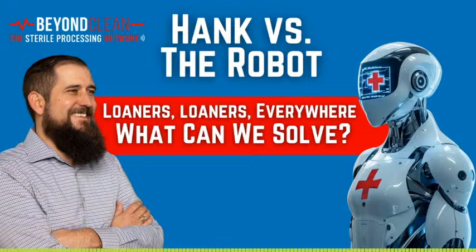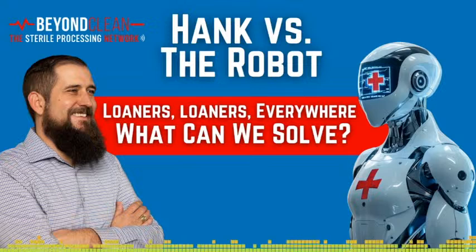Great question, Hank. Loaner instruments are essential because they bridge the gap between hospitals' core instrument inventory and the specialized tools needed for specific procedures. Not every facility can afford or justify owning every type of surgical instrument, especially those used infrequently or for highly specialized surgeries. For instance, think about complex spine or orthopedic cases. These surgeries often require unique, high-cost instrument sets that aren't part of the hospital's standard inventory. Loaners allow facilities to provide cutting-edge care without bearing the financial burden of purchasing rarely used instruments.